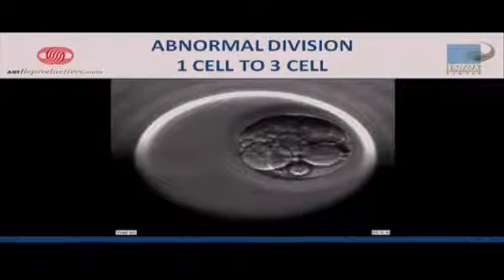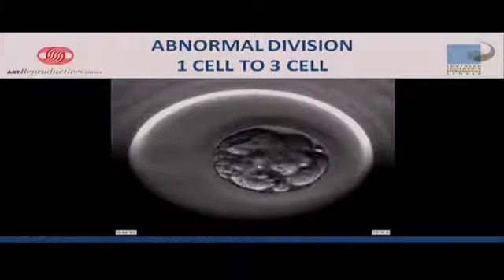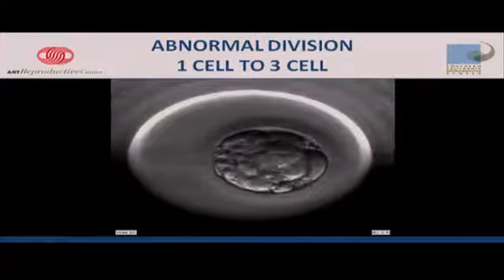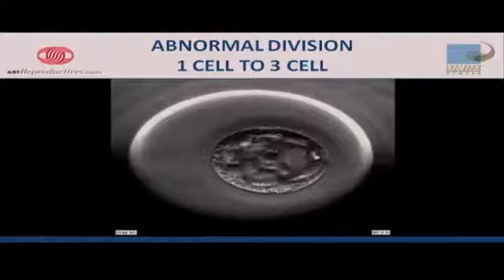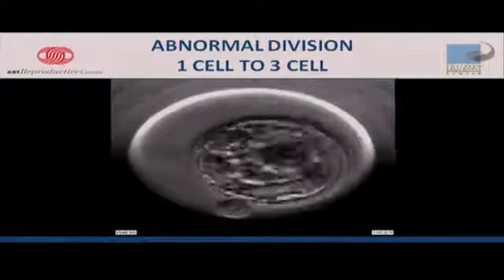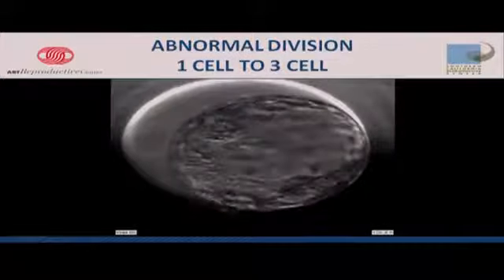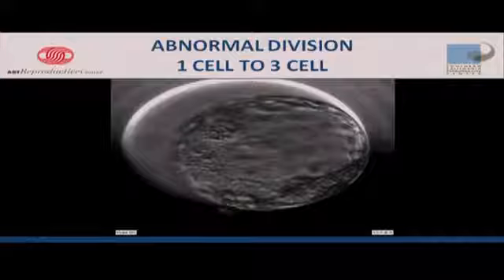But we watch it, and we let it continue. We saw something bad, but we continue, and we continue. And we actually see that it still does form a blastocyst when you go all the way out. Now, if you only look at very specific time points, like Denny talked about, those static observations, you would see a blastocyst at the end that's hatching out and that actually does have an inner cell mass. Not the most beautiful one, but it's got one.